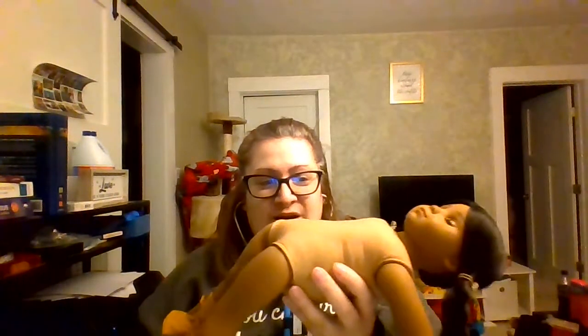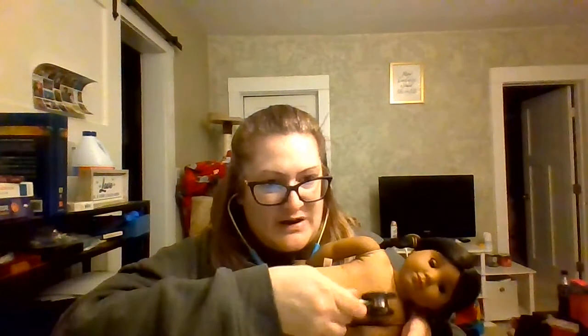So here, just to kind of see the measurements when the person is moved and in different positions. So like I said, we pretended she was laying down, but she looks like a code blue, so I stood her up. So we're going to put her on her left side, left laterally, and we're going to again find the apex, mid-clavicle, 4th to 5th, and listen while she is this way.